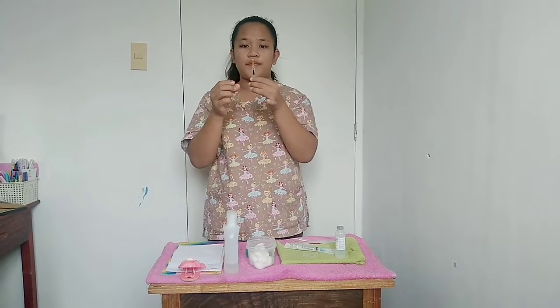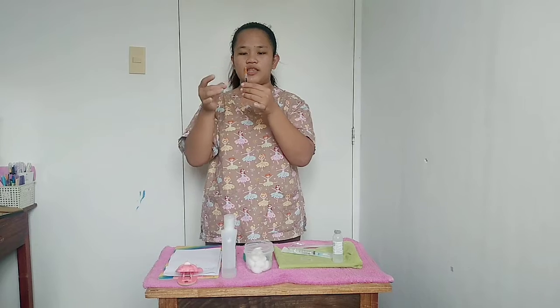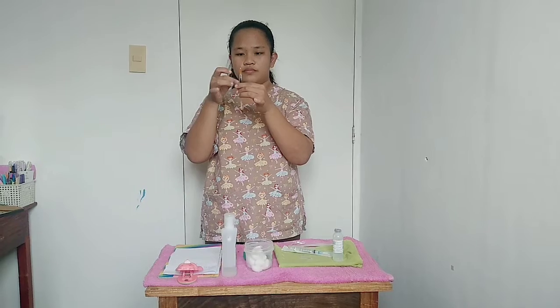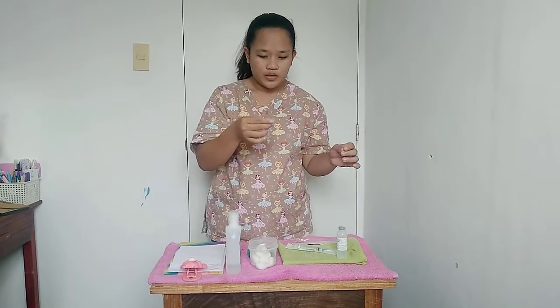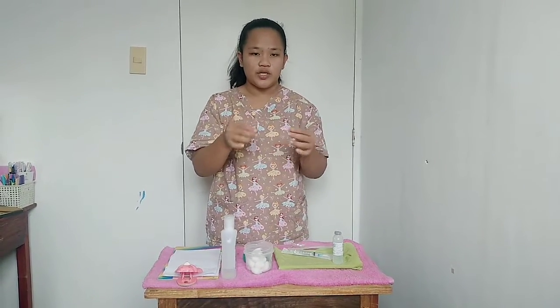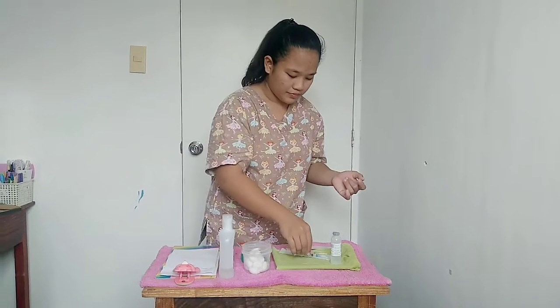If there is a bubble on the syringe, gently tap the needle. And then now we are going to recap the needle and put the syringe or the medication in the hypodermic tray.